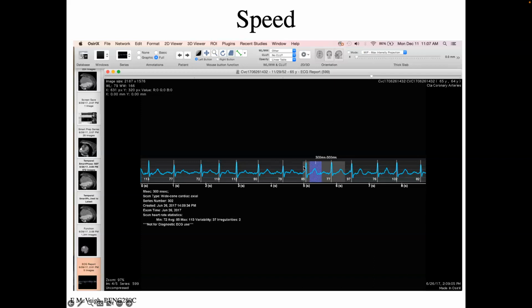What's shown here is data for an image that was reconstructed with the data obtained across this time width here. This gray box tells us you actually have data for this entire time width. So you can reconstruct multiple pictures with different temporal offsets. I could take this purple window and pass it across the bigger window where I have data and just create images that are time delayed.